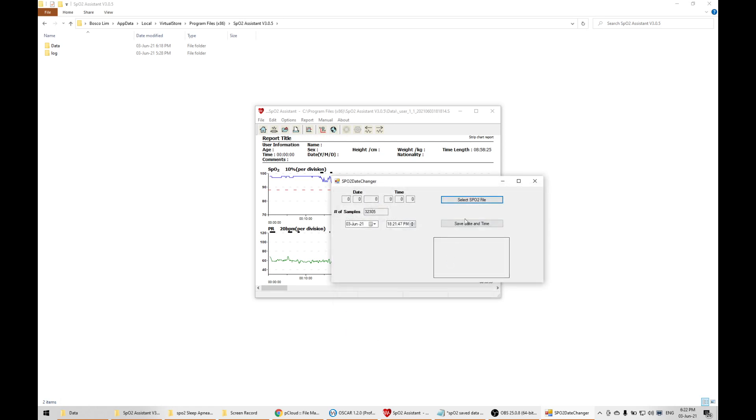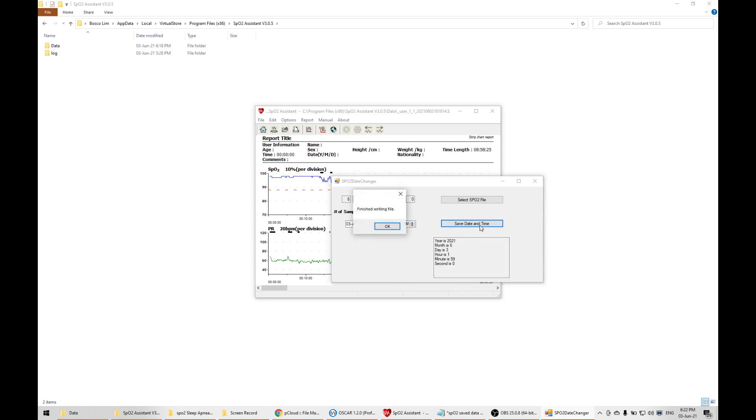I click in and go to the date. I know the time is actually 1:59. When I click save date and time, the date and time will be written into the file because the CM50D Plus doesn't come with a clock.